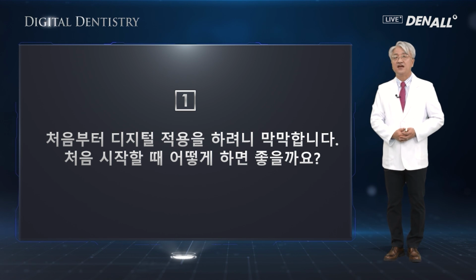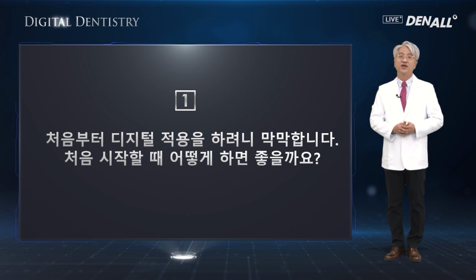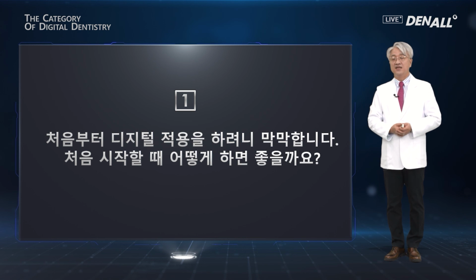Now, digital dentistry can be applied in many different areas, and to do that, you need an oral scanner, milling machine, and 3D printers, all needing to be set up. Of course, you also need different software, which is not easy.